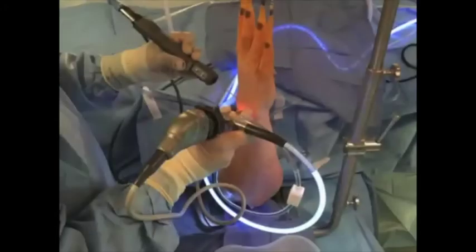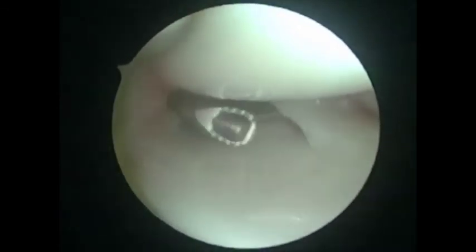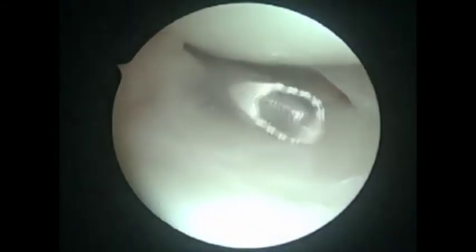Once the stalk has been located, a 5-millimeter incision is made through the skin with a 15-blade, again positioning it in the axial direction. This establishes the working port through which the shaver is then passed. The stalk is debrided back to the dorsal wrist capsule, along with any accompanying synovitis. The shaver is used in oscillation mode at up to 3,000 RPM.